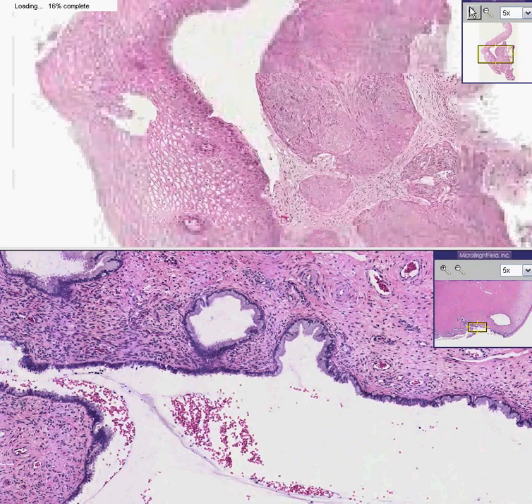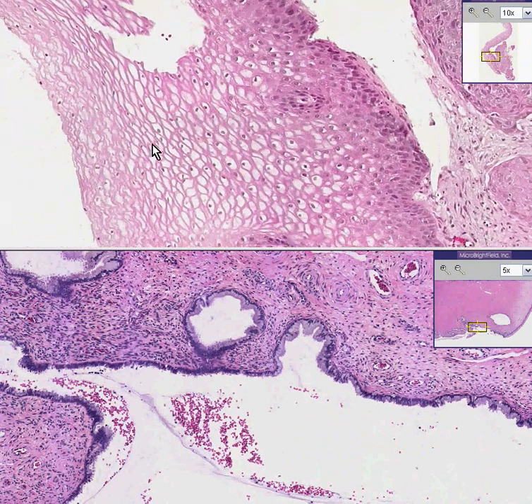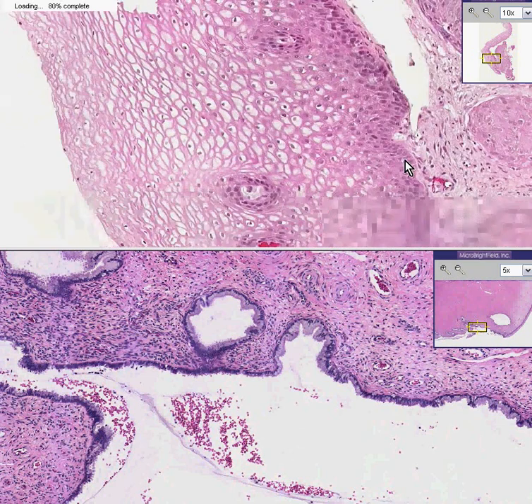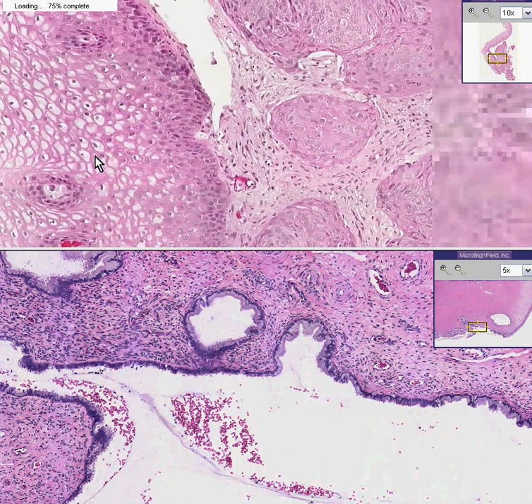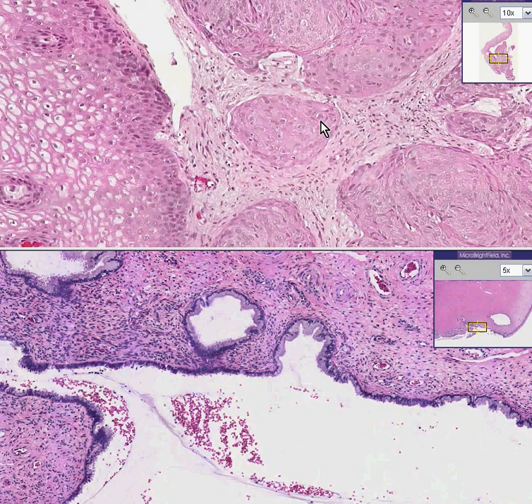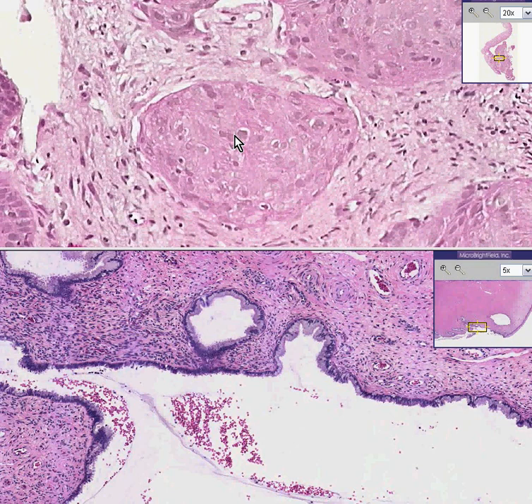Sure, you can see that we have a little strip of squamous mucosa in which, even though there's no stroma underneath, perhaps here there is, you can see good maturation from these little tall soldiers, the columnar cells at the bottom, going out to these flat guys here at the top. Notice also, however, that within the stroma, you have nests of cells completely surrounded by stroma. This is infiltrating squamous cell carcinoma.